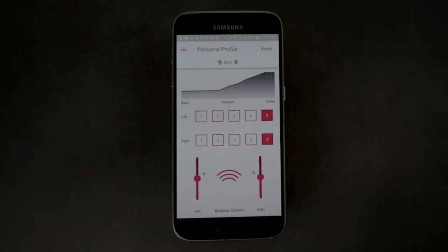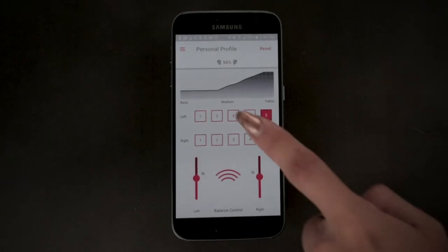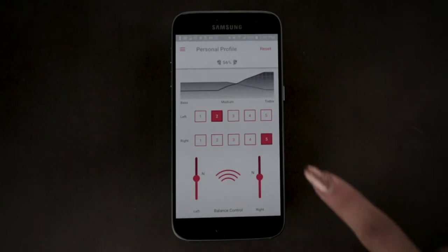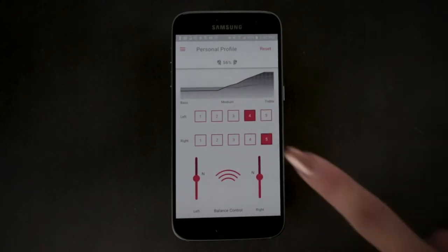In some cases, the left and right ears do not hear evenly and it may be necessary to choose a different setting for each ear.